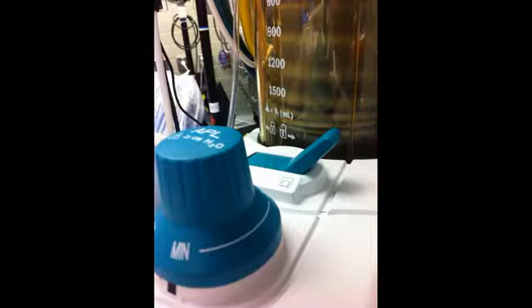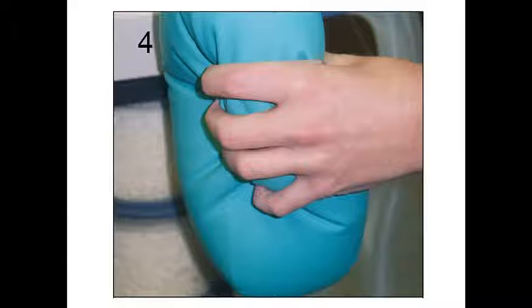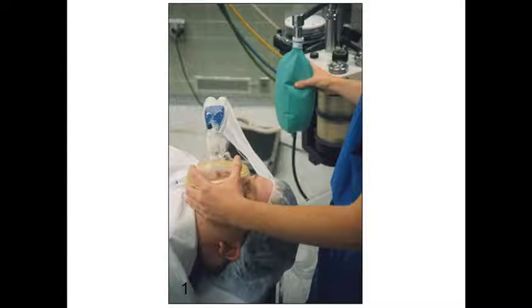This round knob in the foreground is the APL, or the adjustable pressure release valve. It controls a small leak, and by closing the valve you can increase how full the reservoir bag is. The reservoir bag is the bag you squeeze when you want to ventilate the patient, but ventilations will not be effective if the bag is flaccid.